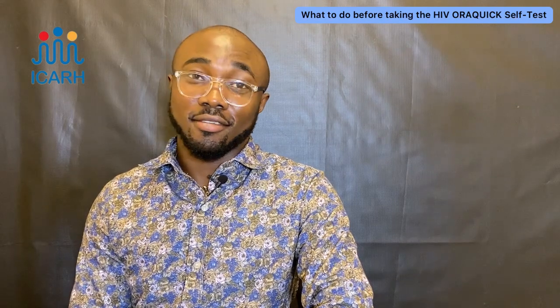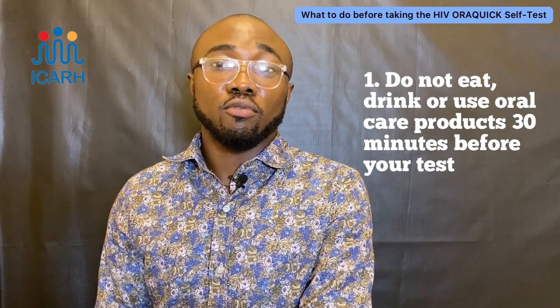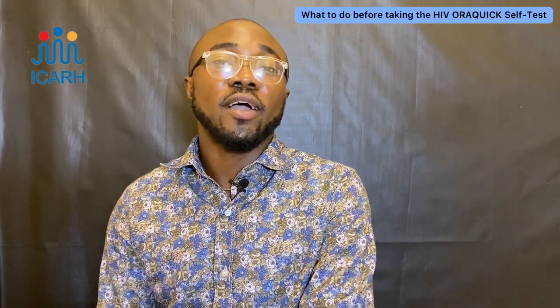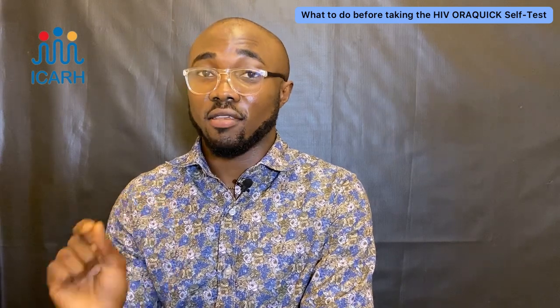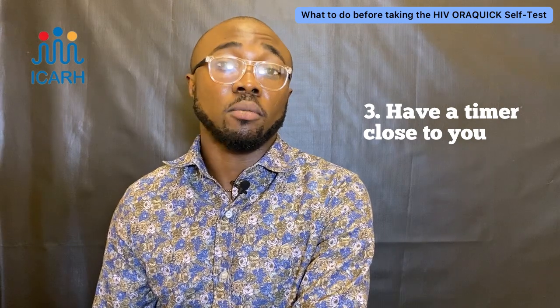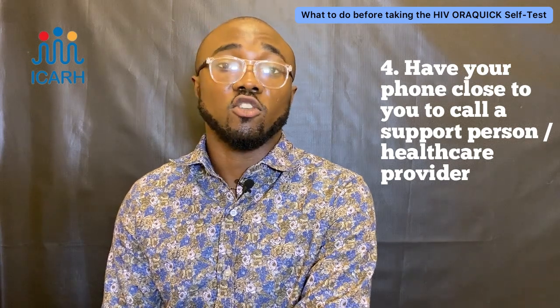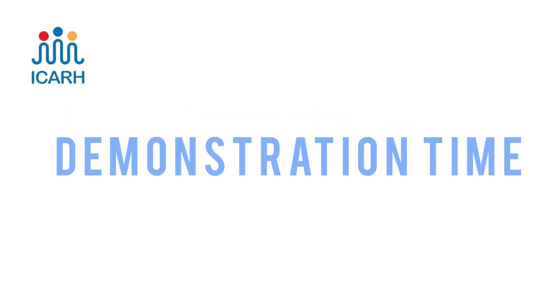Now that we know some basic facts, here are things to do before taking the test. Number one, don't eat, drink, or use oral care products like toothpaste or mouthwash at least 30 minutes before using the test kit. Number two, find a quiet place for at least 20 minutes. Number three, make sure you have a timer set. Number four, keep your phone close in case you need to call a support person or healthcare provider.